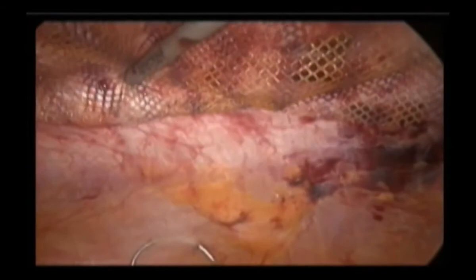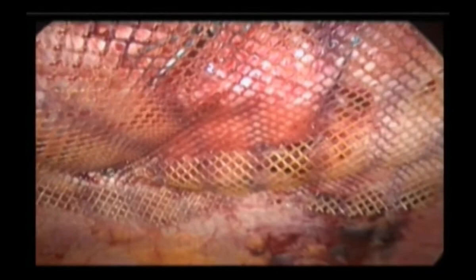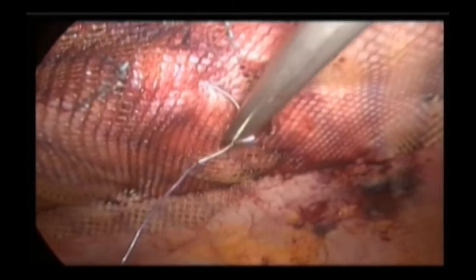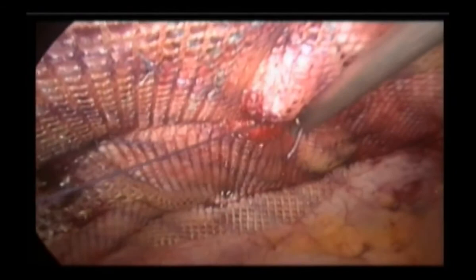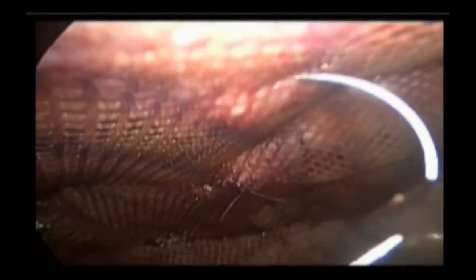Look at the mesh that remains fixed in the middle, uniformly fixed all around. Then put 4 or 5 tackers and 4 or 5 Vicryl sutures in addition to the tackers. We now have absorbable tackers, which are a little more costly than metal tackers but are absorbable. Those who cannot afford tackers can put sutures instead — transfascial suturing is not that easy, but one can definitely try; it is not difficult. Four or five sutures as well.